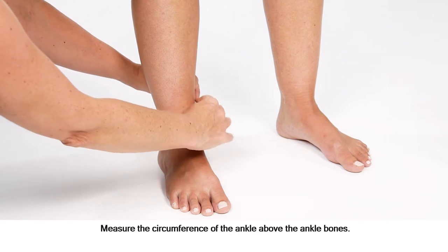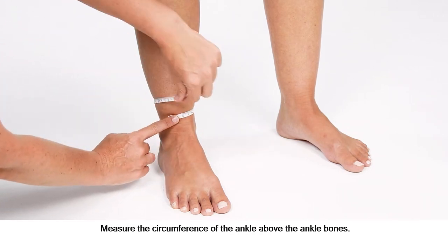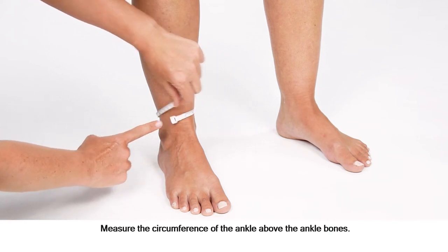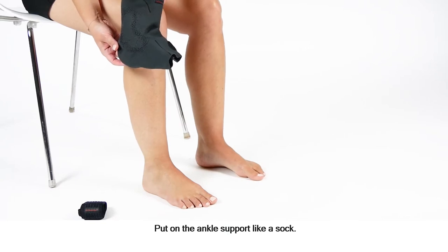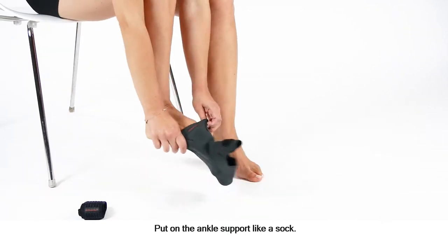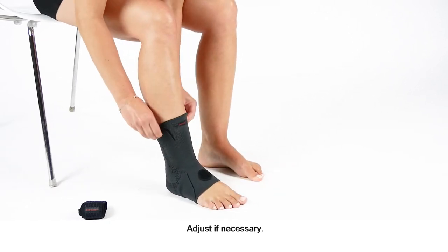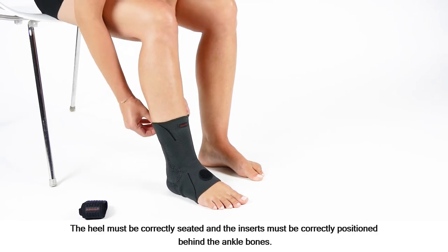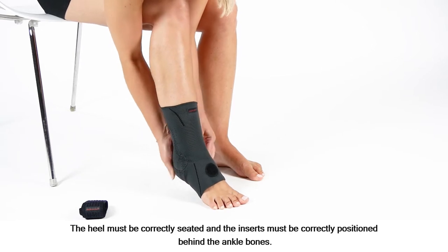Measure the circumference of the ankle above the ankle bones. Put on the ankle support like a sock and adjust if necessary. The heel must be correctly seated and the inserts must be correctly positioned behind the ankle bones.